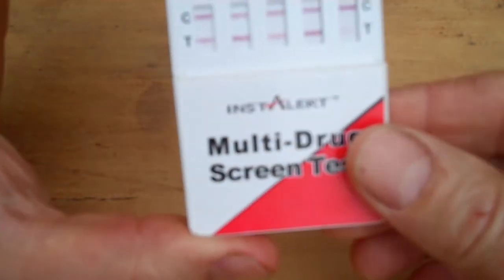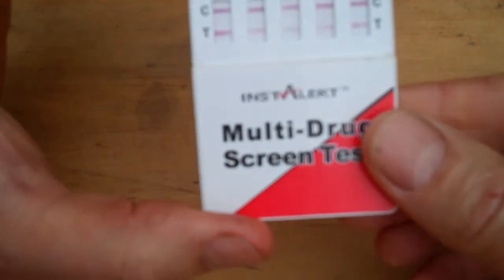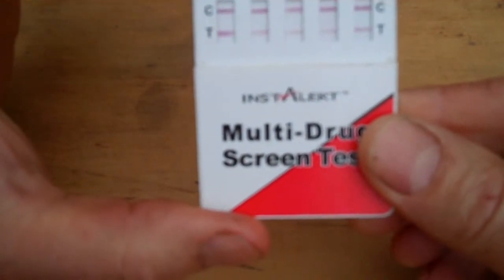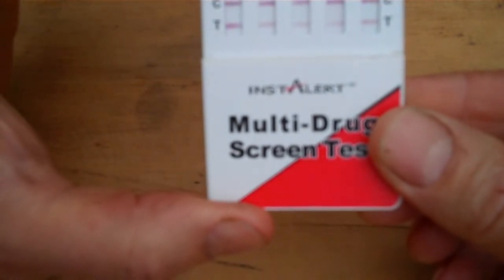So you are looking at a turnaround and operating time in terms of negative results being shown on these test panels in 1.5 to 2 minutes. So it's quite physically possible to do one every 5 minutes in terms of a screening procedure. That's the sort of time you should be allowing yourself.